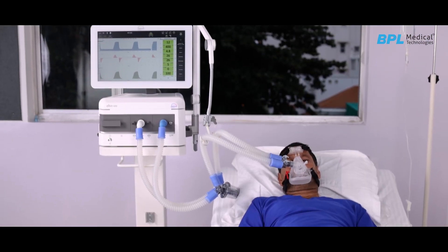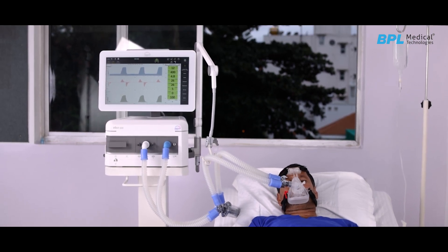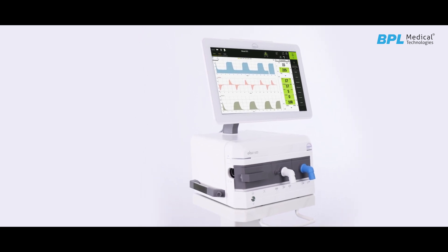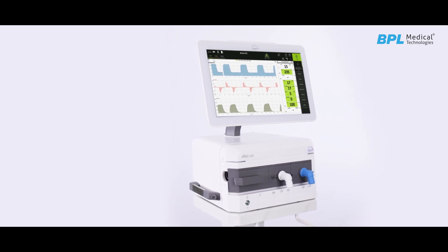It is a high-end critical care ICU ventilator that can be used in all medical disciplines. The device architecture and smart user interface, with its focus on hygiene and service, makes it an ideal solution for ventilation needs.